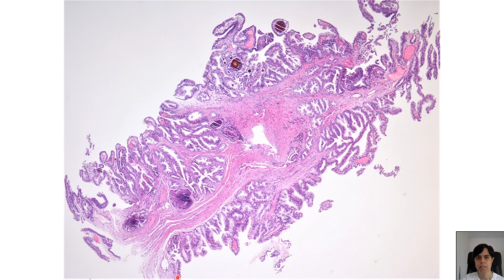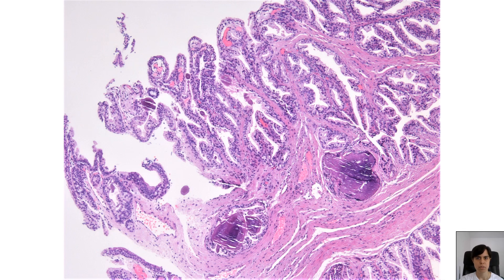Here is a low-power view of a lesion described on the cystoscopy report as a small papillary mass protruding into the urethral lumen from the posterior wall. We see a fibromuscular stroma containing benign prostatic glands with their typical undulating luminal contours and some intraluminal concretions or corpora amylacea. The surface epithelium mostly resembles that of the prostatic glands and is covering delicate papillary projections with true fibrovascular cores. On a closer view, we also notice some intermixed benign urothelium focally, and we can better appreciate the papillary nature of the lesion with these thin, true fibrovascular cores.